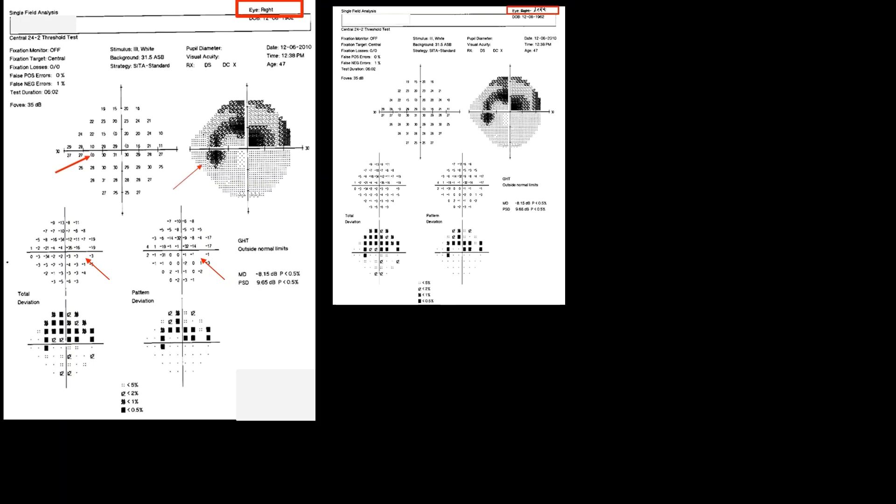This visual field printout of the right eye shows superior arcuate scotoma and the blind spot plotted on the left field of vision in the raw data and grayscale map. In both numeric and probability display of total and pattern deviation, the two points nearest to the typical location of physiological blind spot are on the right field of vision.